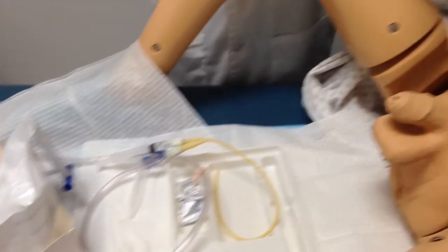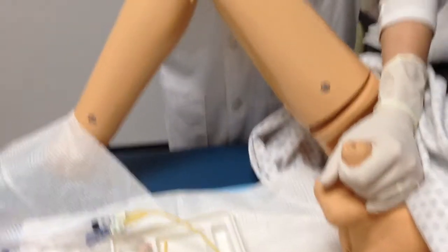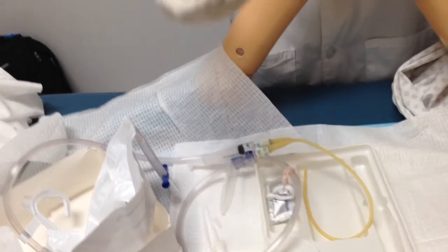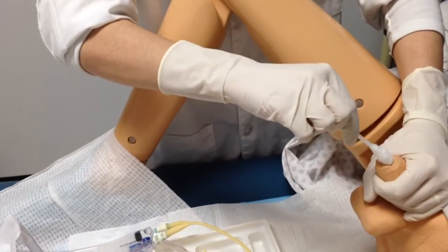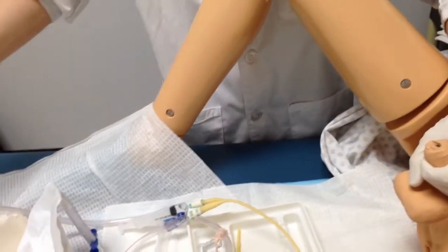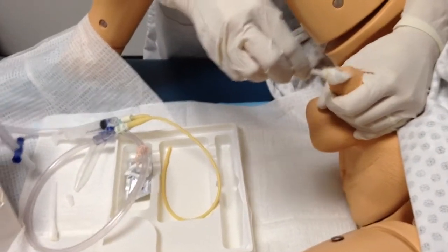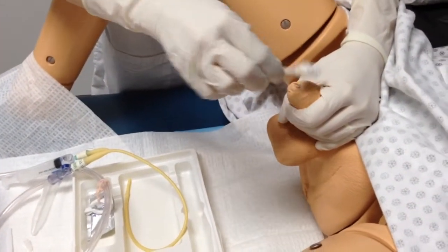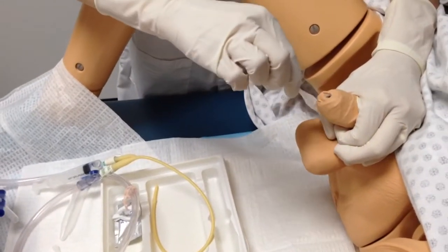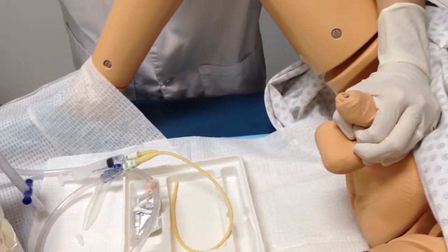So this hand is no longer going to be sterile. I'm going to go ahead and grab it with my left hand because I'm right-handed, so I'm at the right side of the bed, and my left hand is my non-dominant hand. With my dominant hand, I'm going to take the first swab, clean in a circular motion on the inside of the penis, and dispose of this in the trash can. The next swab, in a circular motion, I clean the outside just a little further out, and dispose of that one as well. And then last, we're going to do one more time further around. Alright, and dispose of this one as well.